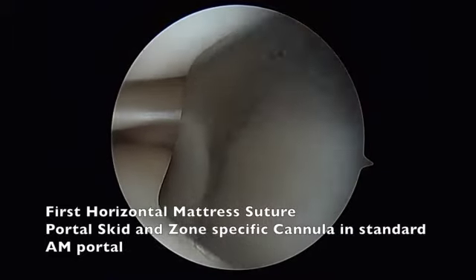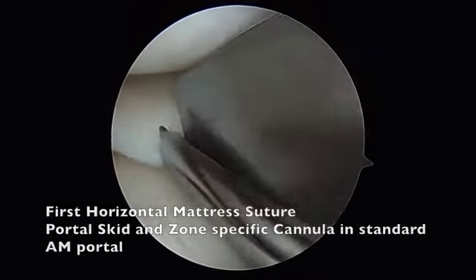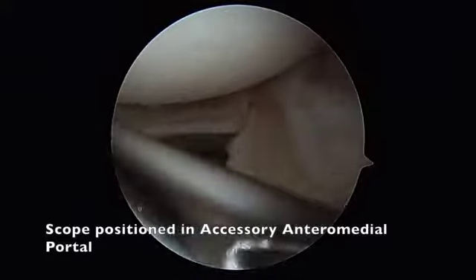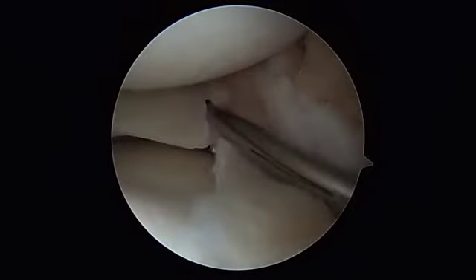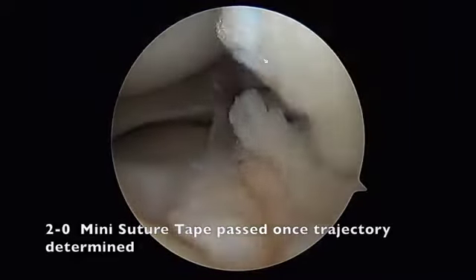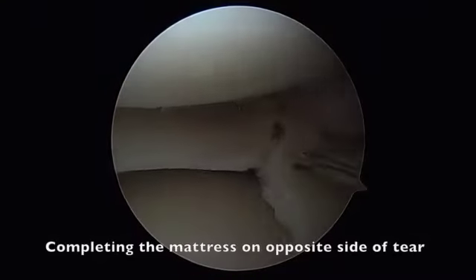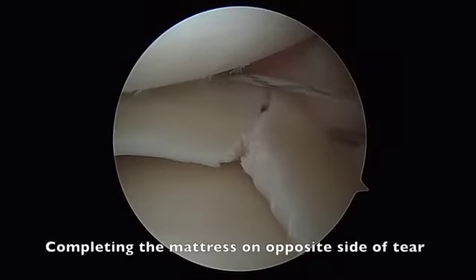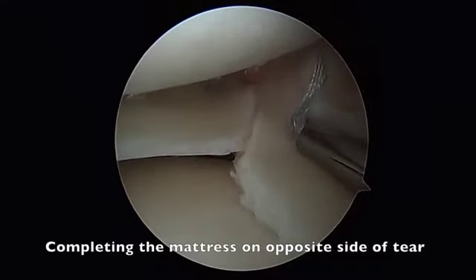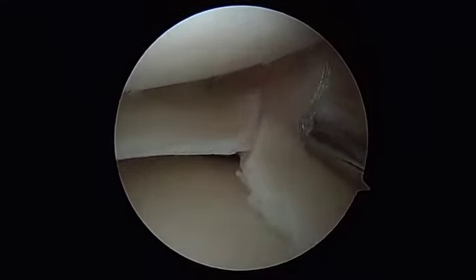This is then followed by the zone-specific cannula. The desired trajectory is determined, and the 2-0 mini-suture tape meniscus repair needle is passed through the zone-specific cannula and into the meniscus and subsequently outside of the knee. The other end of the repair needle is passed on the contralateral side of the meniscus to create a single horizontal mattress stitch.